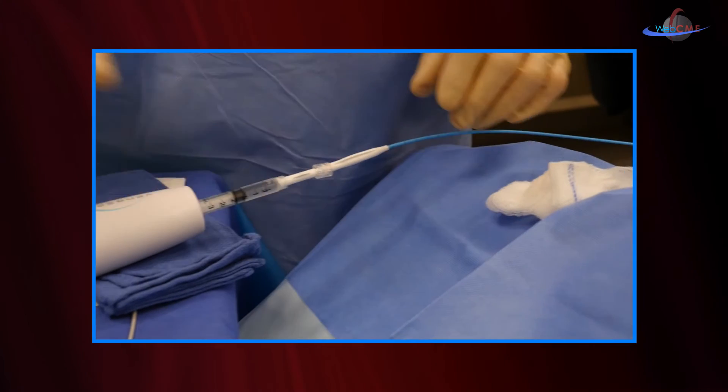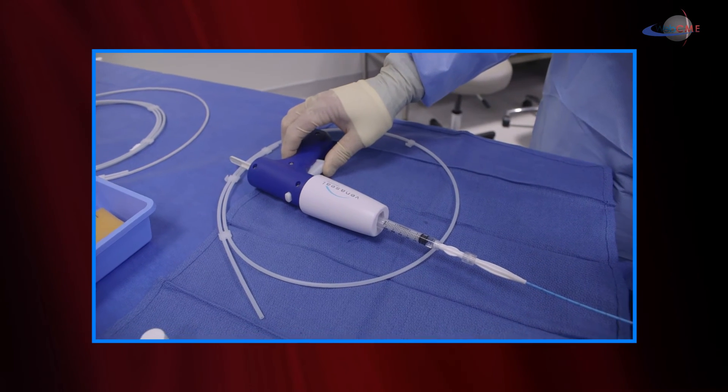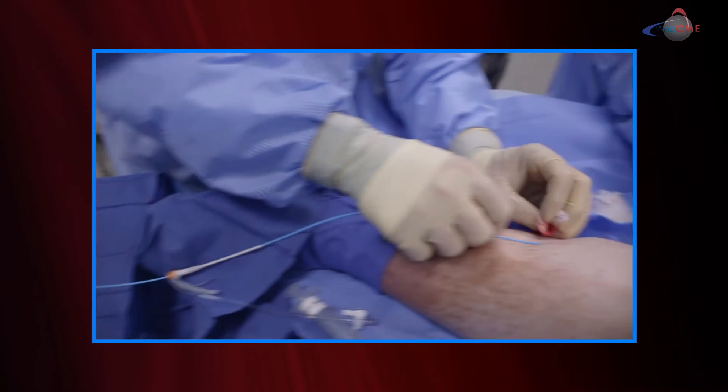The procedure is essentially the same when treating, except that we have to use tumescence — a solution of saline and lidocaine — which is injected along the length of the catheter to prevent the patient from experiencing pain during both laser and radio frequency treatments. When we use venous seal, or gluing the vein, we don't have to use tumescence.